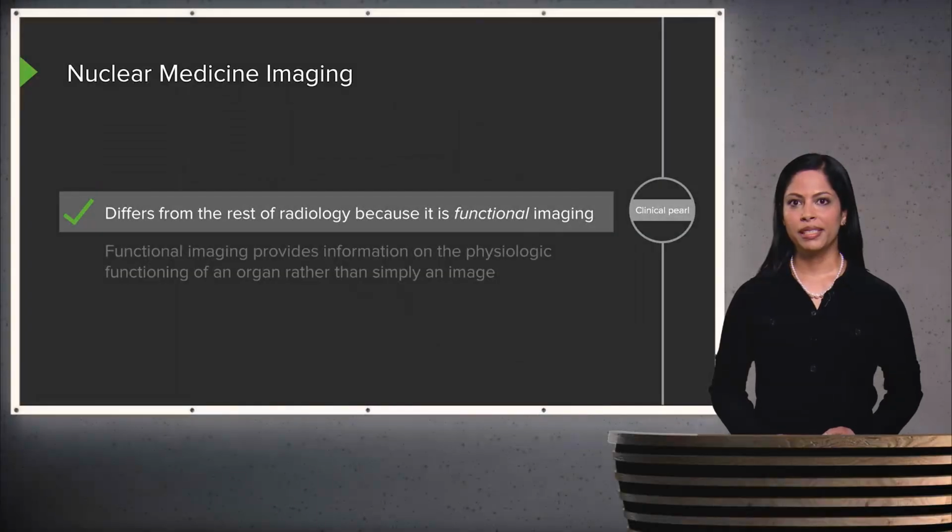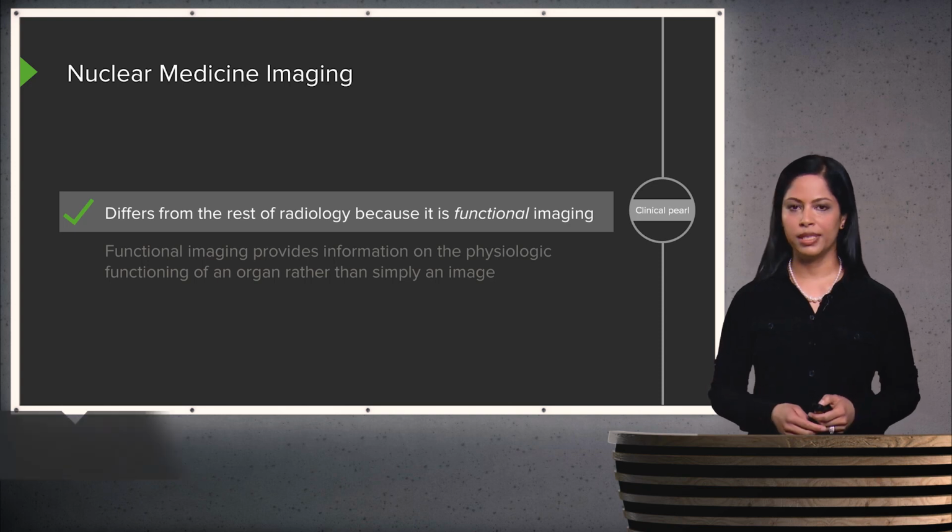So in this lecture, we'll be discussing nuclear medicine. We'll talk about how nuclear medicine is different from the rest of radiology, and we'll review some common nuclear medicine examinations and some common uses for those examinations.